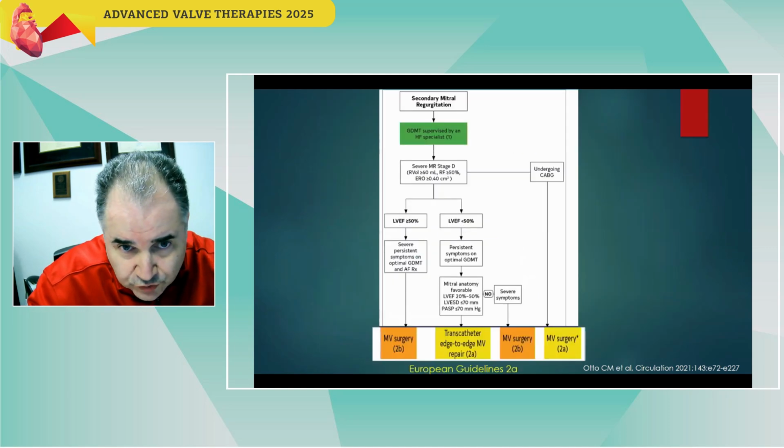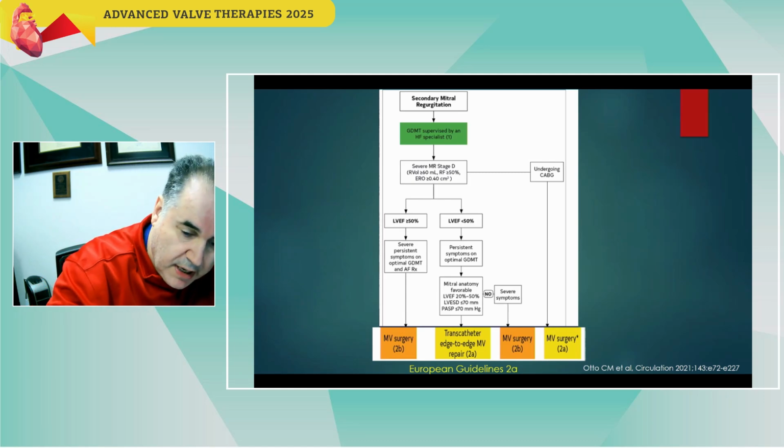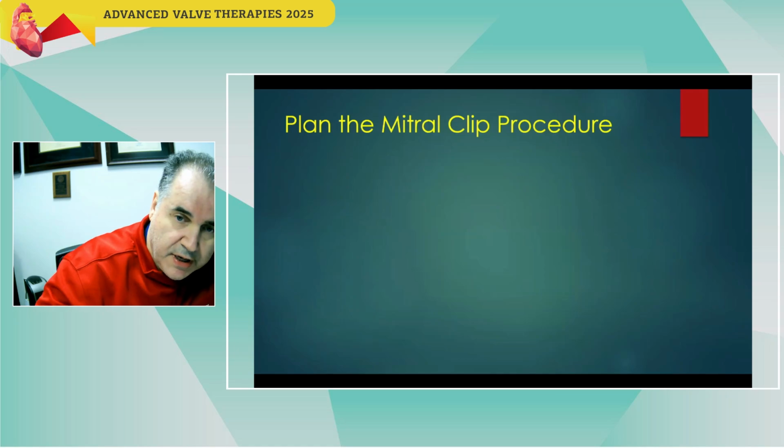For patients with secondary MR who meet the COAPT criteria, it is a 2A indication in both the European and the American guidelines to perform this procedure.